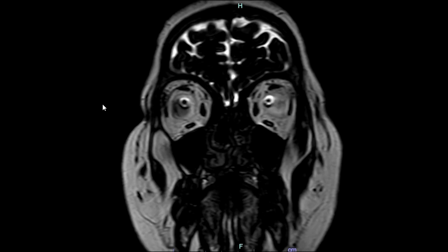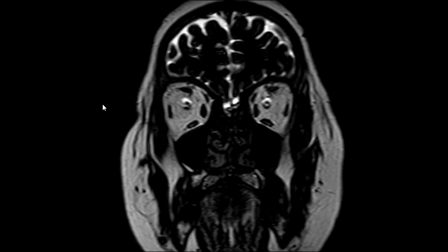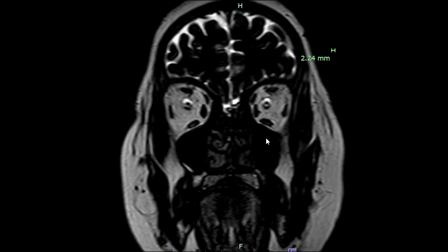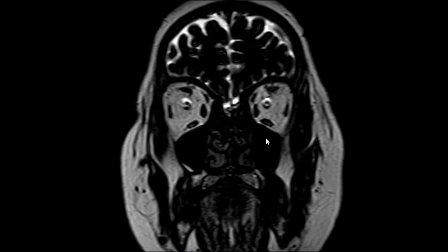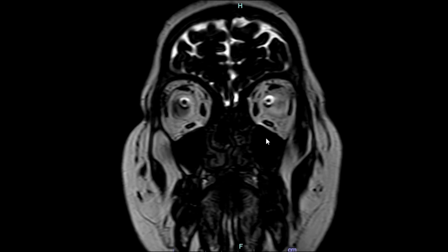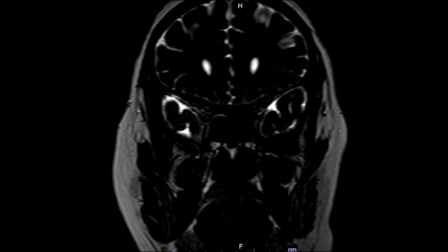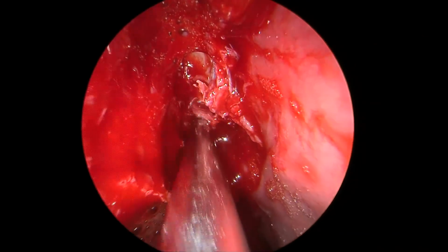What you see now is a heavily T2 weighted MRI image, which also shows you the CSF in a white color. And now you see how one can see the meningeal sac and a slight tracking down of CSF on the right side skull base defect at the junction of anterior and posterior ethmoids, which was seen earlier.